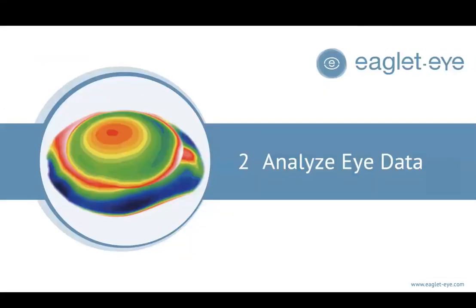Now, step 2 is analysis. So this is where things start to get really fun. This is where you can use the data to really speed things up in the clinic. And I want to share with you just a little bit about what the maps look like and give you some examples.